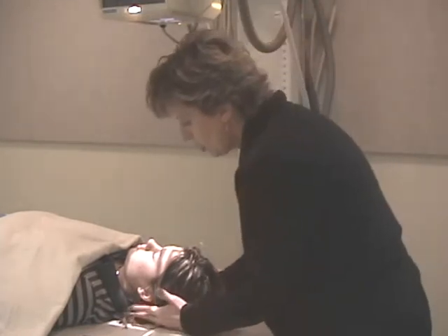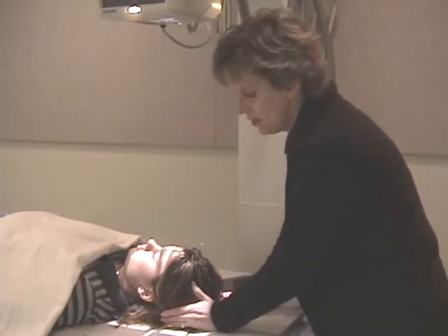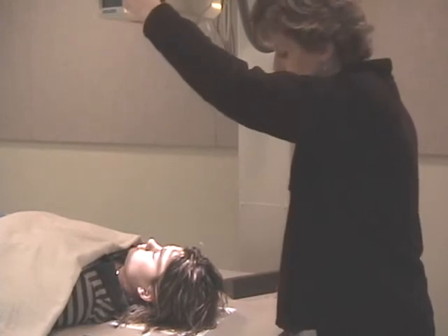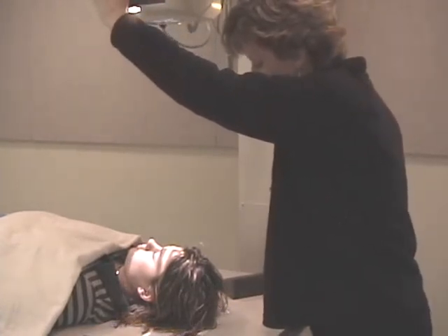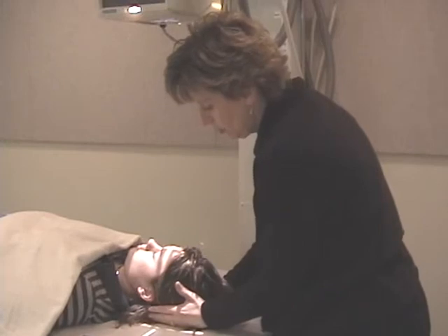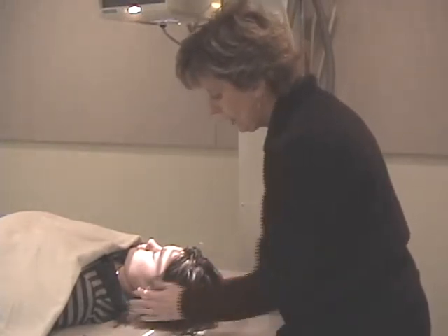Drea's skull is smaller. You can see the light on the tabletop. And actually the gauge says this is just shy of 10 by 12. Well, her skull is small enough that I can bring this collimation in that way and side to side, making sure I clear the anatomy. So you can see a little bit of light on the tabletop. And I'm doing that on both sides, making sure I'm not clipping pertinent anatomy.